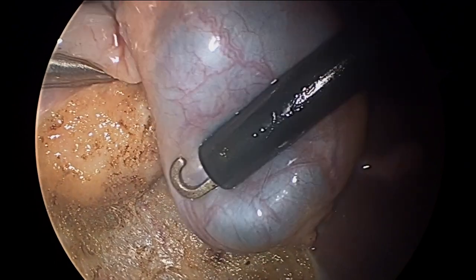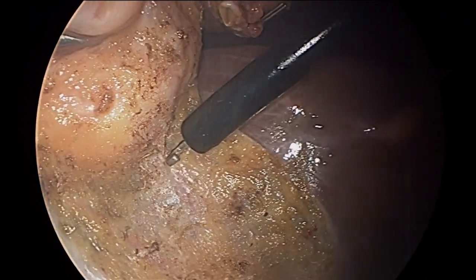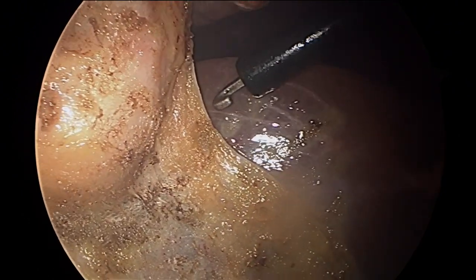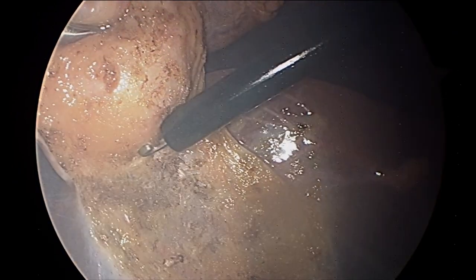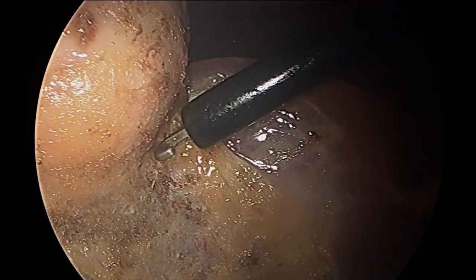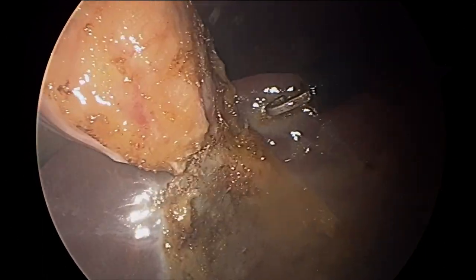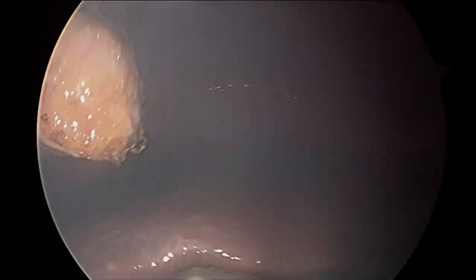There's that grasper again. You see that little blue egg thing? That's the gallbladder — that's a grasper picking it up, and here comes the cautery again. You have to be careful here so as not to injure the liver. Everything looks good, and it's almost free. It's been there for a long time — sometimes it's reluctant to let go. Almost there. Bingo. So that's the gallbladder and the grasper.